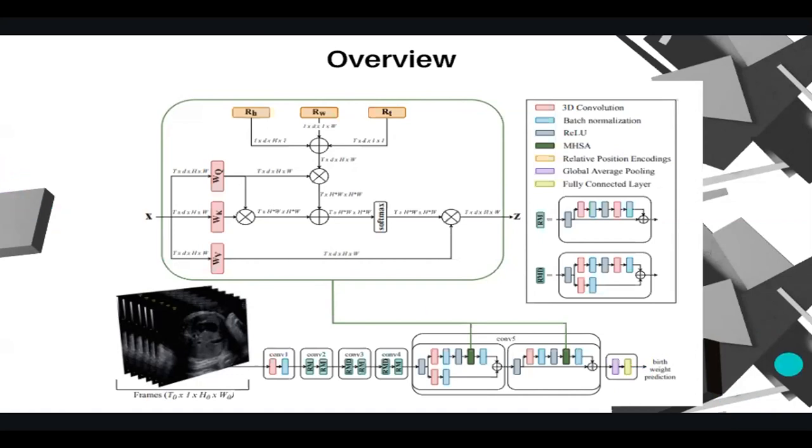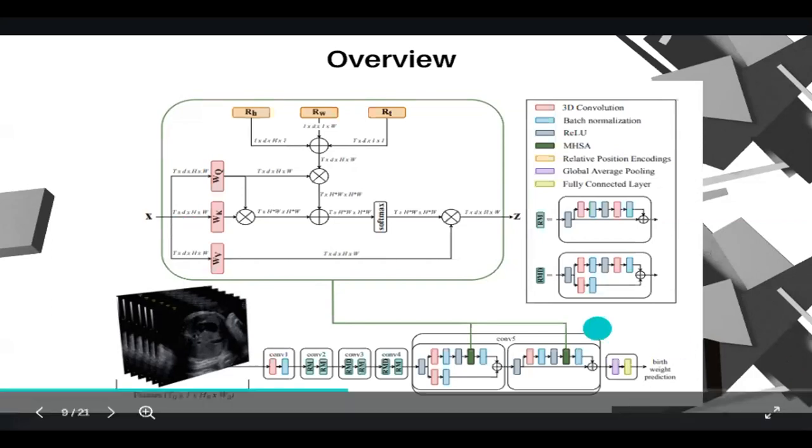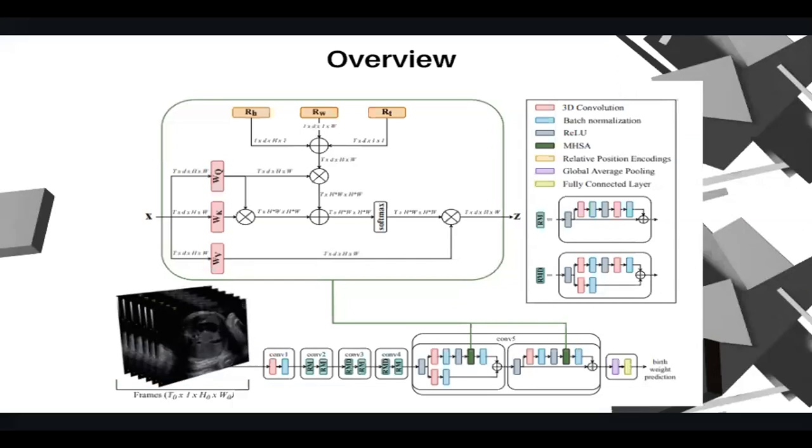This model takes 16 frames, which you can see on the bottom left, as the input to make a single segment prediction. They're divided into non-overlapping frame segments, and then the final prediction is made by averaging all of these predictions together.